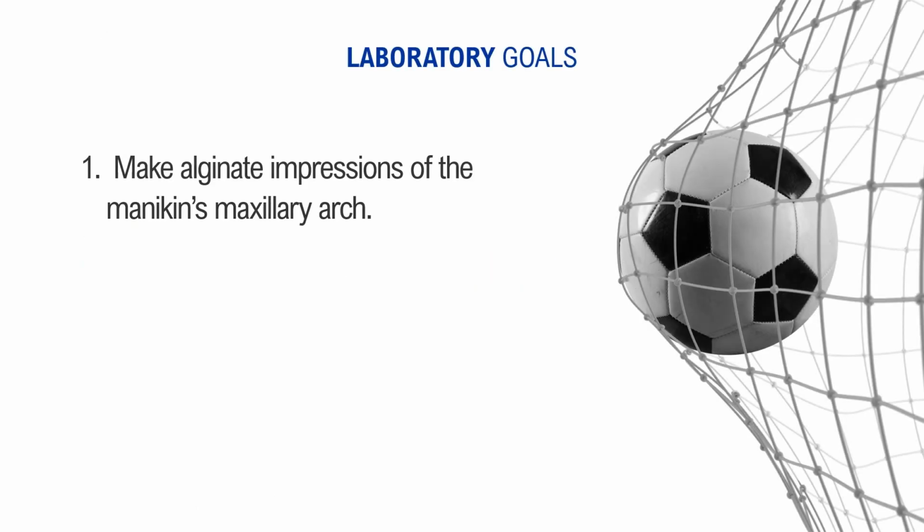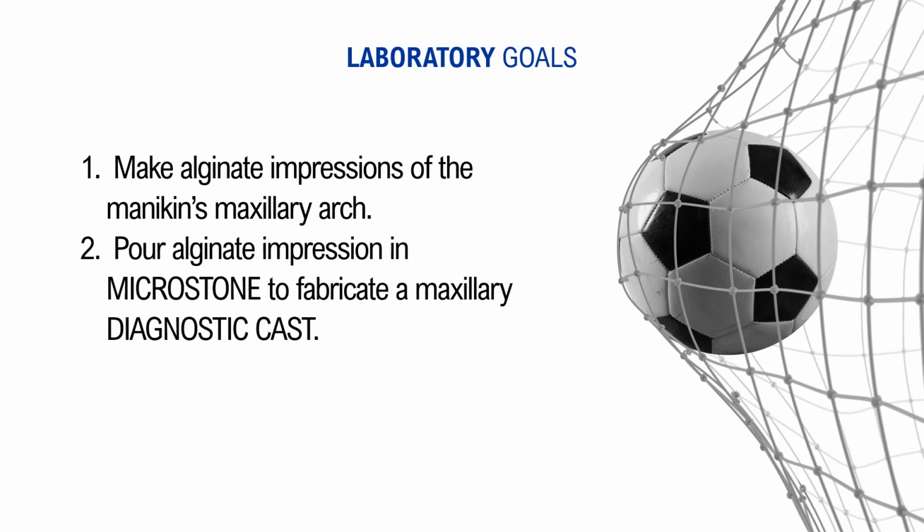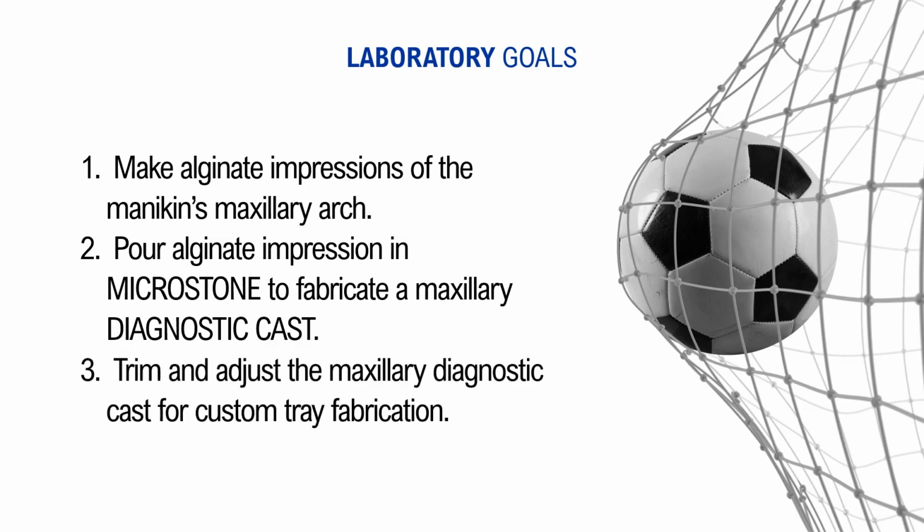What are the lab goals for the specific sessions? What you will be doing. Make alginate impressions of the maxillary arch of your mannequin. Pour alginate impression in microstone to fabricate maxillary diagnostic cast. Trim and adjust the maxillary diagnostic cast for custom tray fabrication.